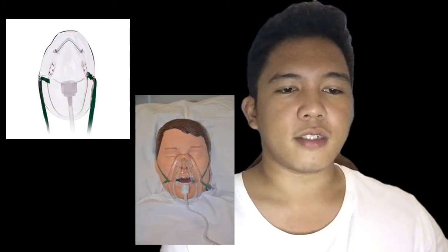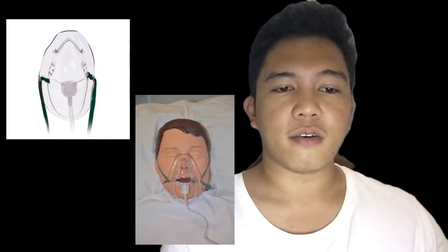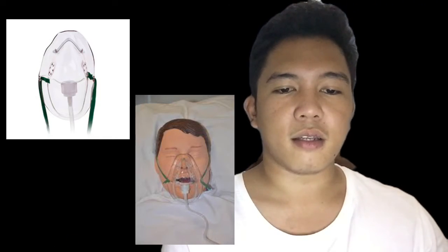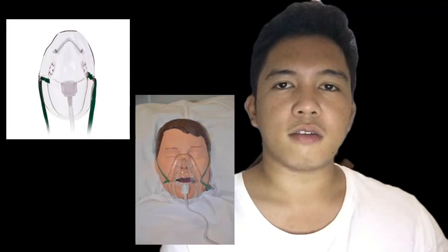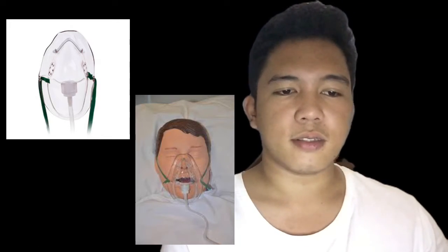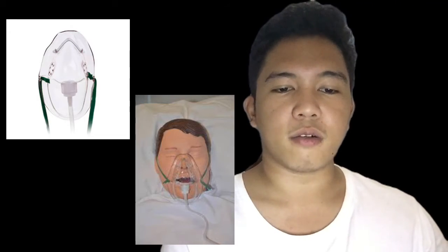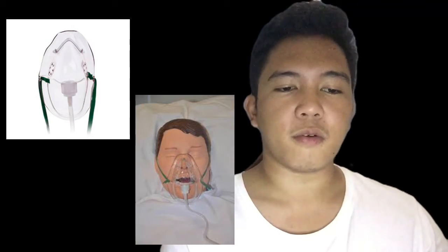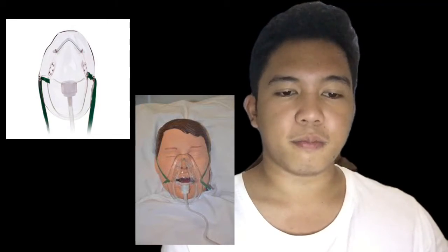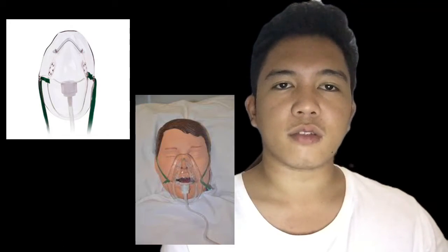There are also advantages of the simple face mask. Quick and easy to set up and apply. Often found at the head of the bed in emergency areas. There are also disadvantages. Non-specific FiO2, dependent on the patient's inspiratory flows. Next is maximum FiO2 estimated at 0.50. And last is not intended for long-term use.